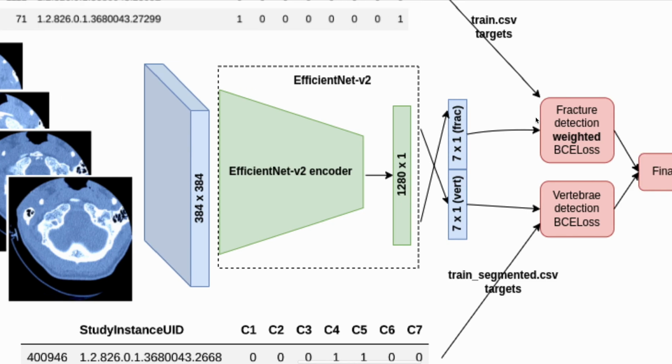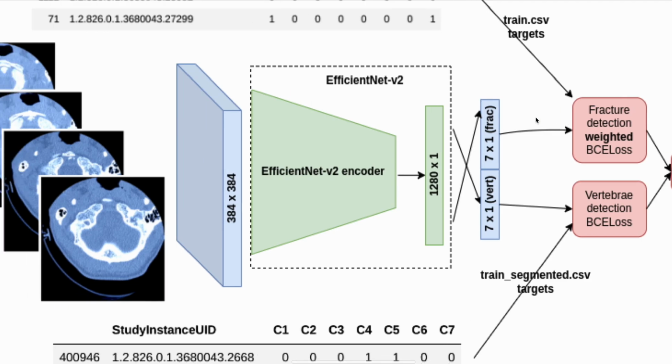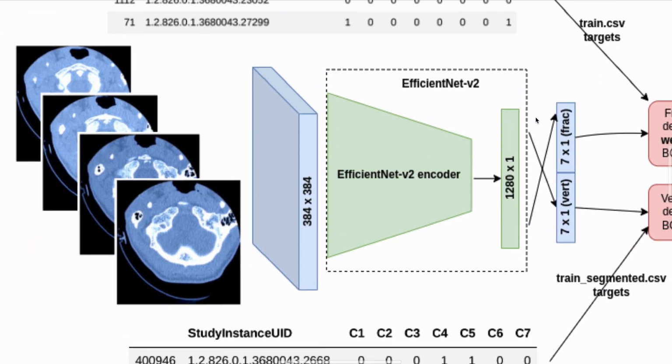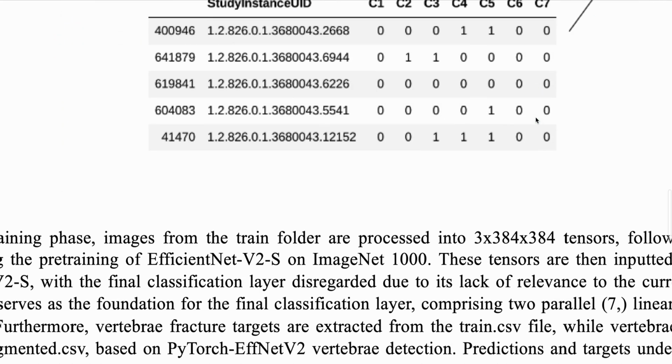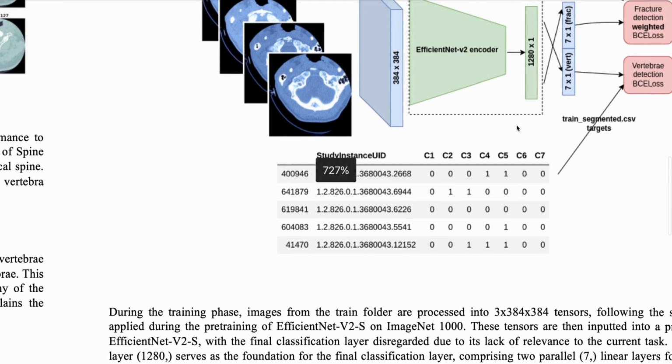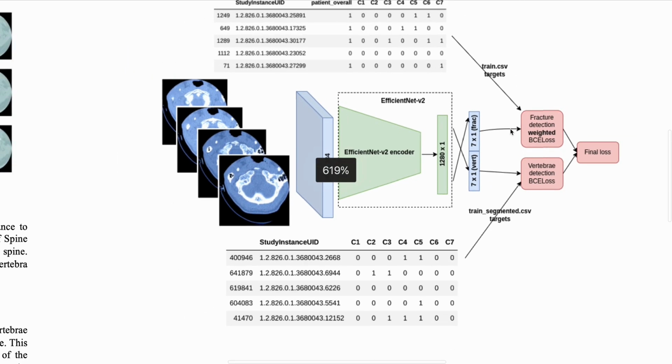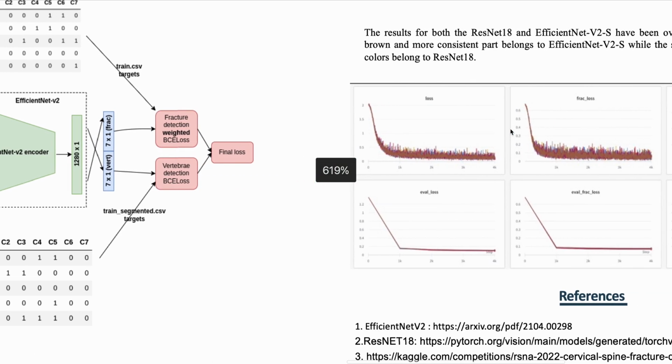And what we've done is we've used weighted loss here. And how it works is that we kind of give a higher weightage to fractures and lower weightage to non-fractures, which could also be reversed to see how it plays out. And what we do is at the end we just use this data, and then we get the final loss, and we can easily predict using this.